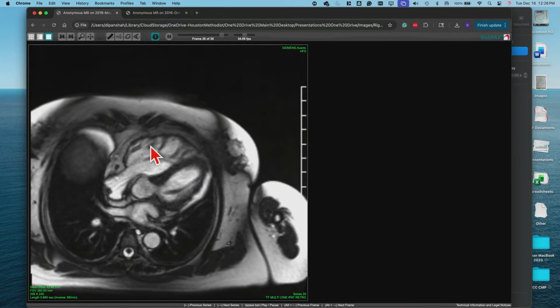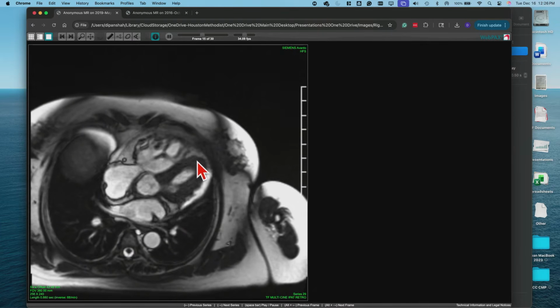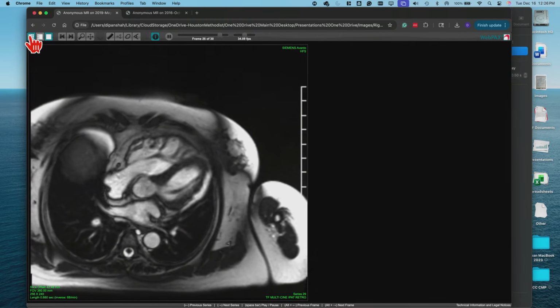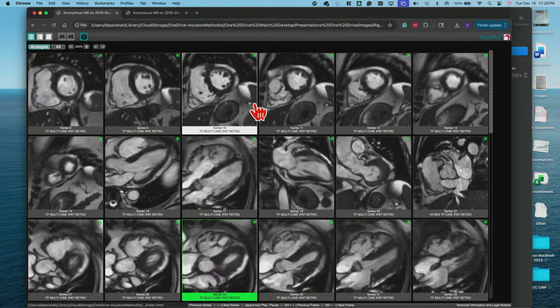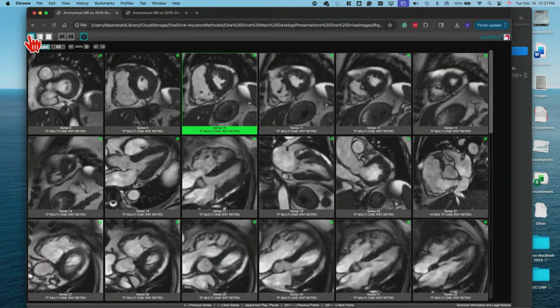You can pass it on. Okay, so the septum, you're wondering if it's a little bit flattened, and I agree with you. And this view is not the best for that. The short axis views will be better, right? It does look like there's some flattening of the septum, okay? Does it look like it's in systole or diastole or both or what? Yeah, so it's probably a little bit of both, right? Again, this is not the most overt case of septal flattening, but there is some flattening, which again goes along with it. There's some RV overload, right?